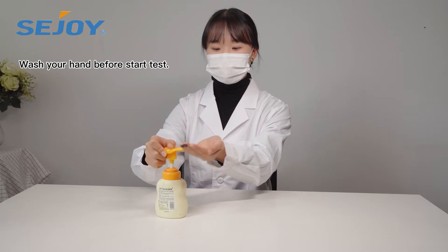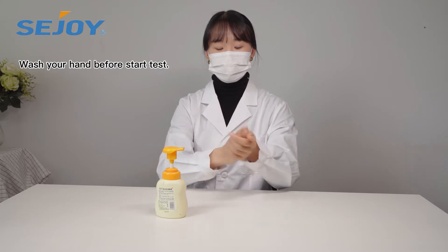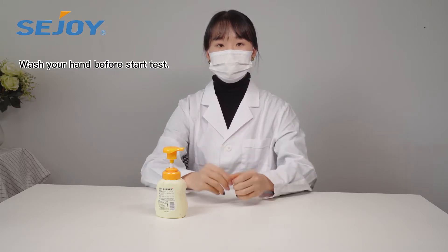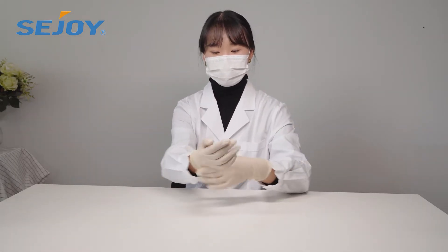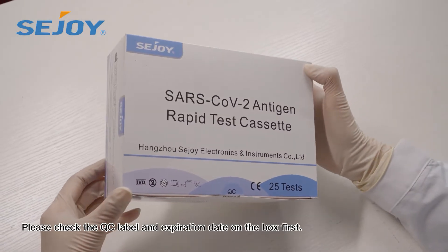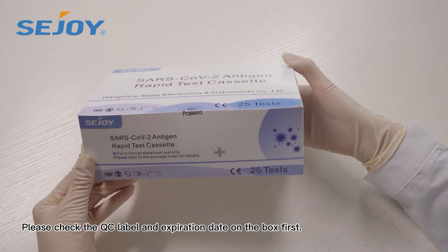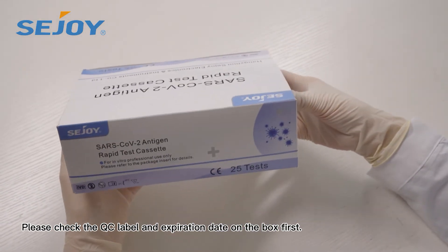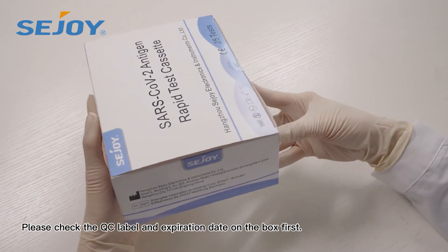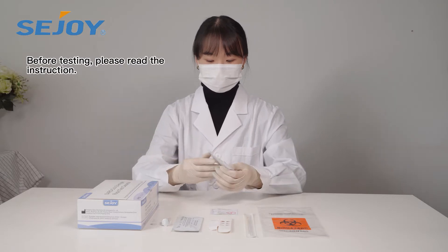Wash your hands before starting the test. Please check the QC label and expiration date on the box first. Before testing, please read the instructions.